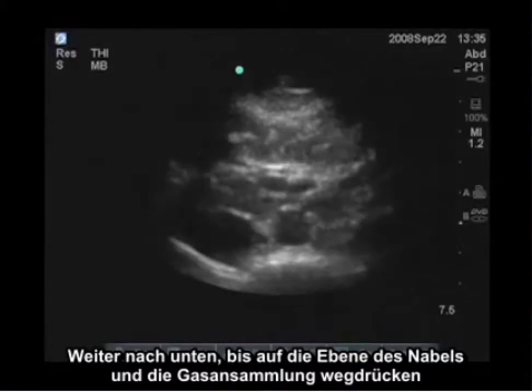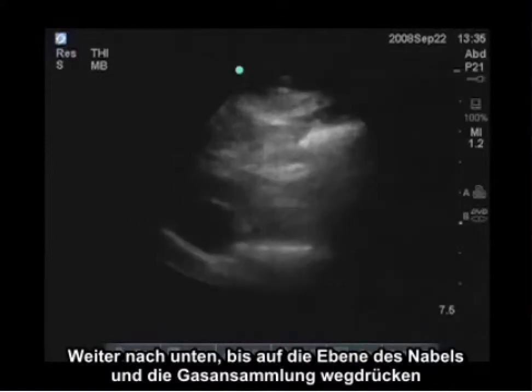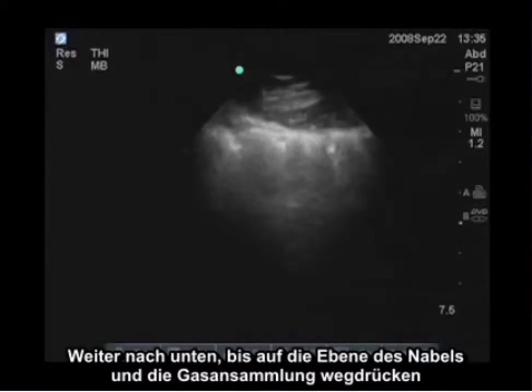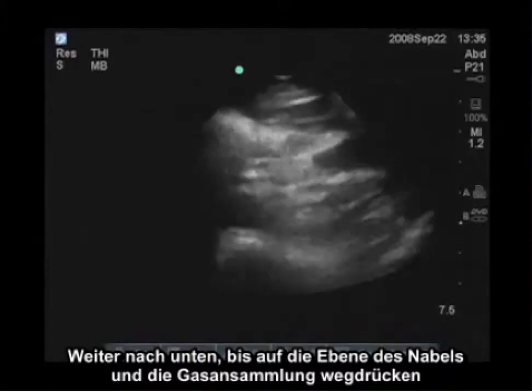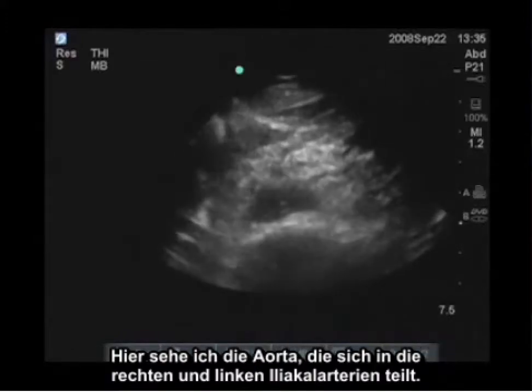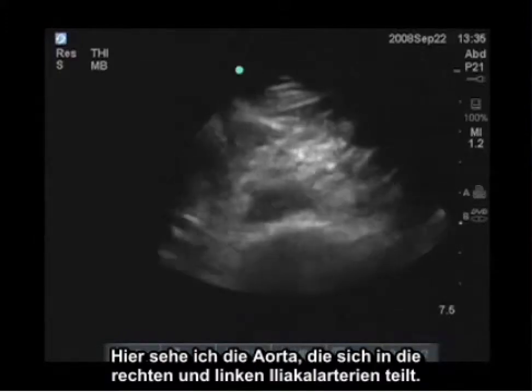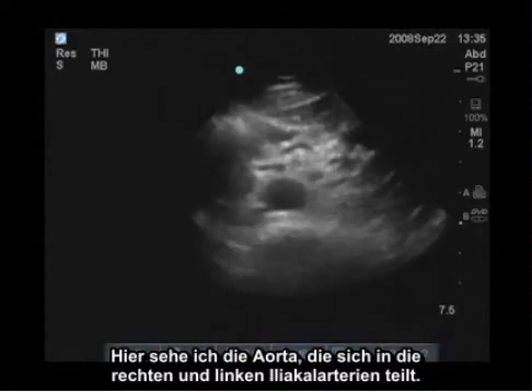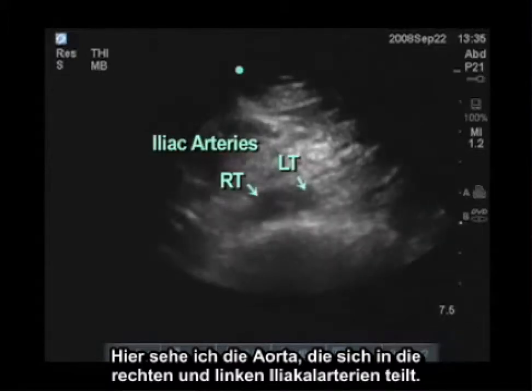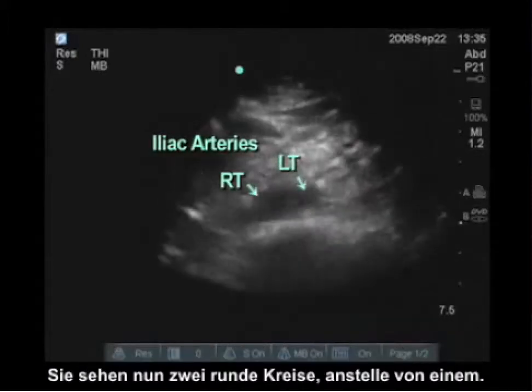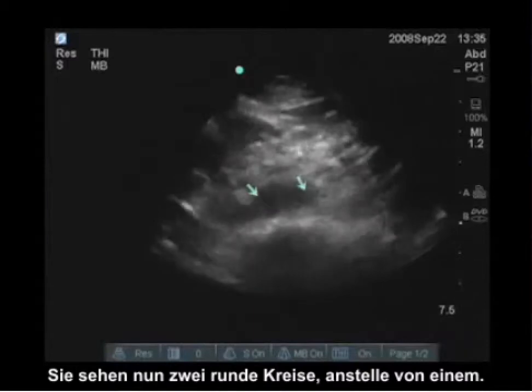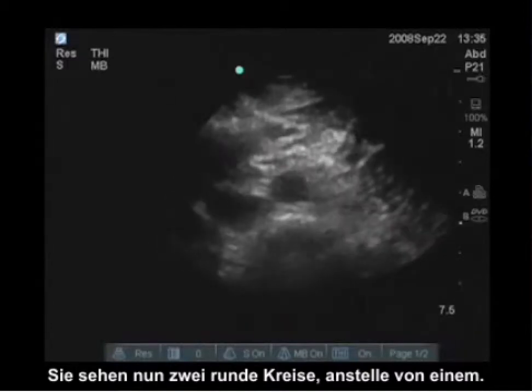I'm going to continue down to the level of the umbilicus, pushing away the bowel gas. Here I see the aorta divide into right and left iliac arteries, so now we see two round circles instead of one.